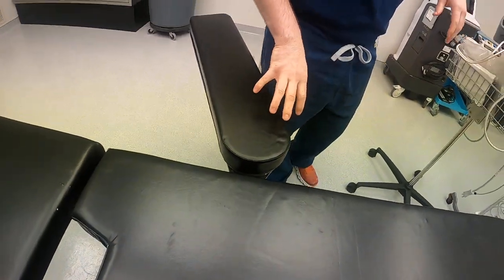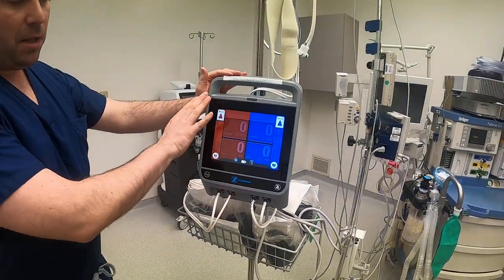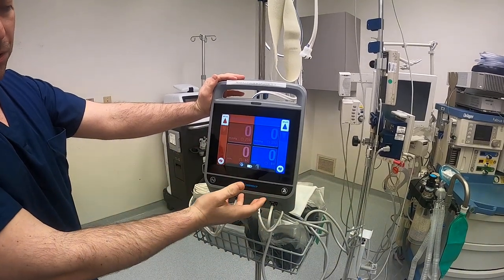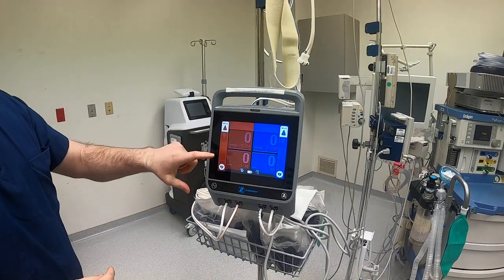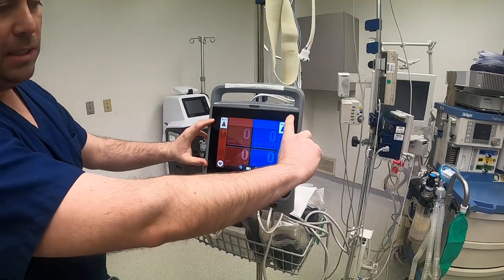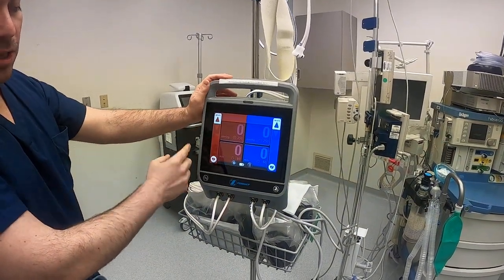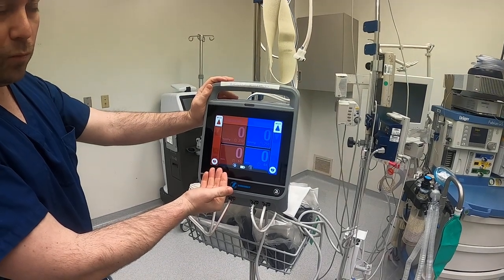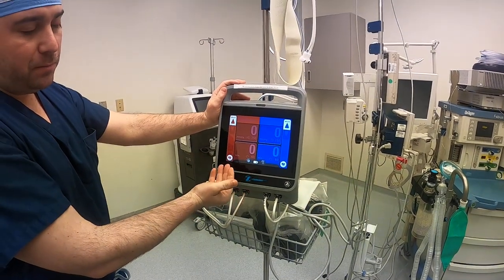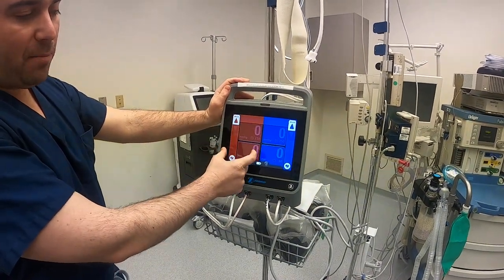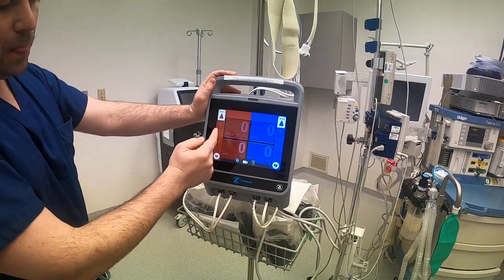Our next step in setting up the room is the tourniquet. A lot of places now have digital tourniquets; some are manual with buttons to push up and down. This tourniquet has two different gauges — a primary and a secondary tourniquet. With the digital ones, we typically set up the primary one first.